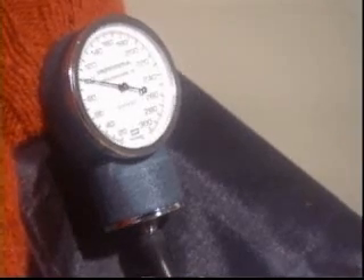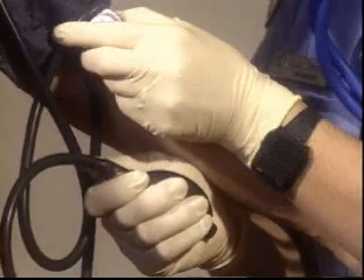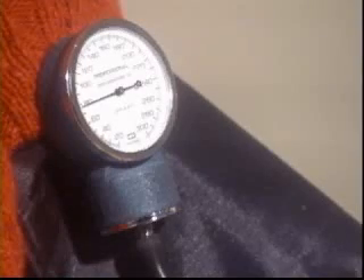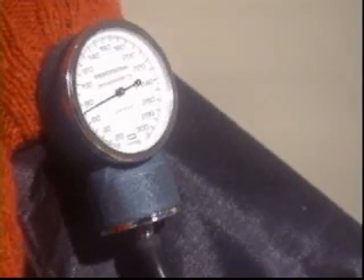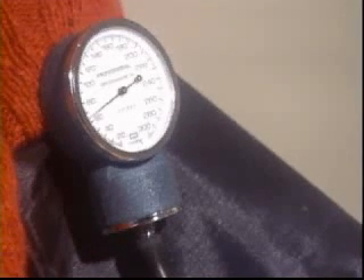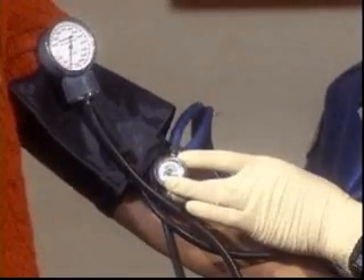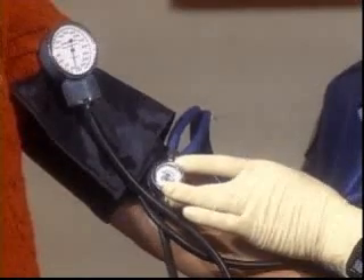Keep releasing the pressure slowly until you can no longer hear the sounds in the stethoscope. The cuff pressure reading at the time when the sound disappears is called the diastolic pressure. This represents the pressure exerted on the walls of the arteries when the heart is at rest.